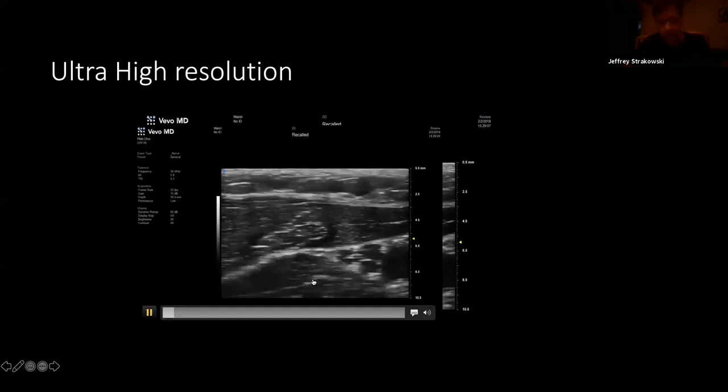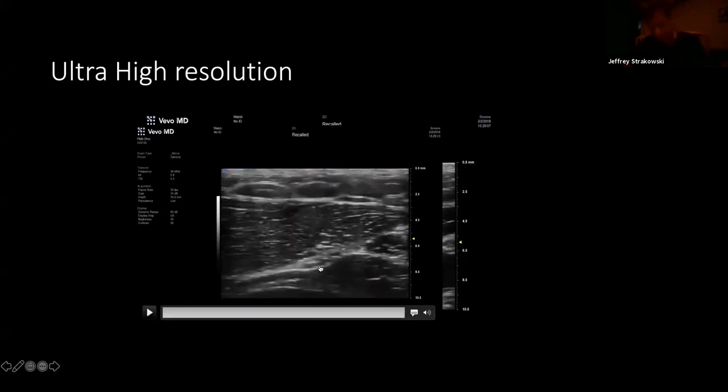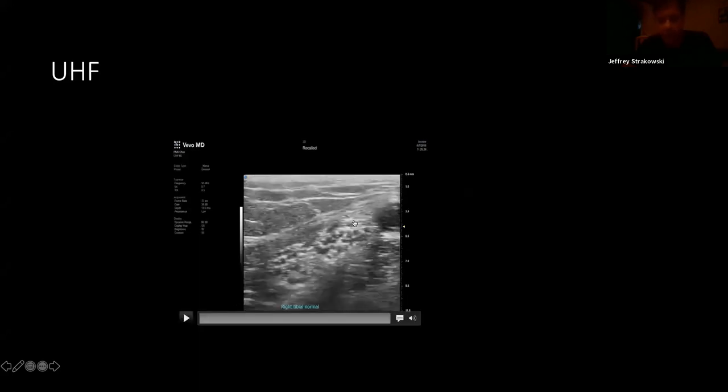they start to move. And you can see the dorsal branch of the ulnar nerve and actually all the number of fascicles that come out, and that'll innervate the dorsal part of the hand. So if we start looking at these in better resolution, we can see even small fascicle injuries, and that makes a difference in some complicated cases.